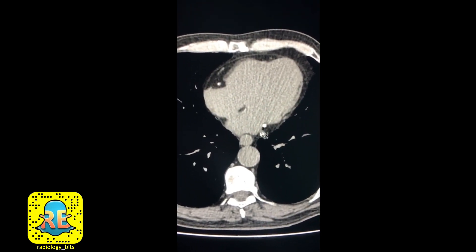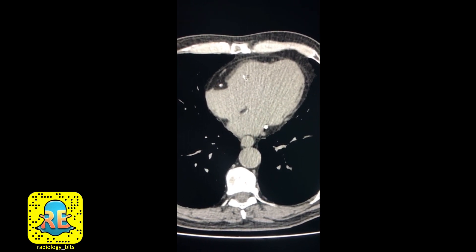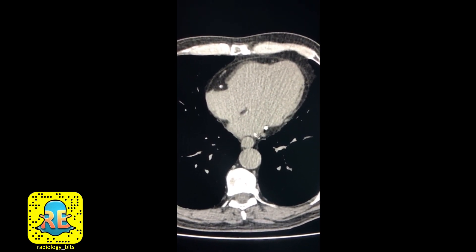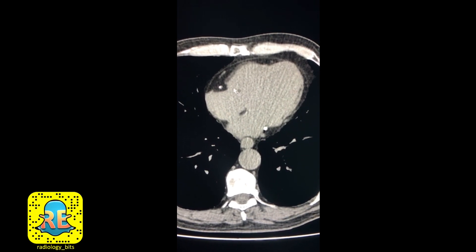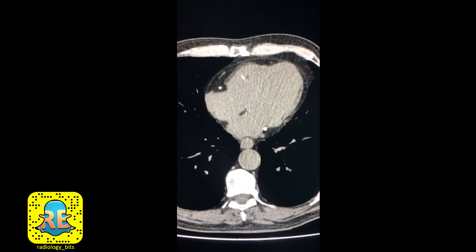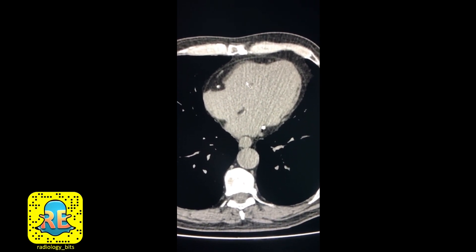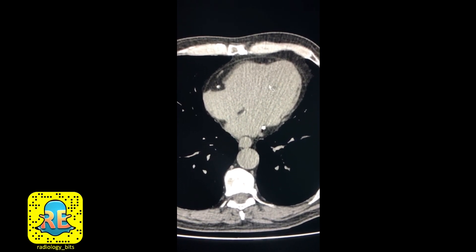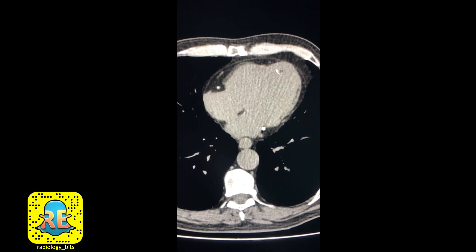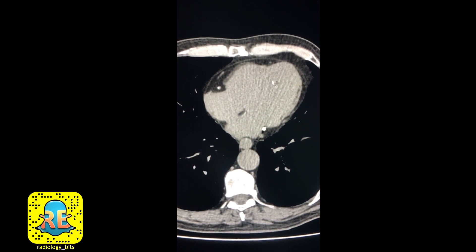What you're looking at is the heart with its four chambers. The heart looks like a soft tissue lump where you cannot differentiate between muscle and cavity without giving contrast. If this were a study with contrast, you would see enhancing cavities and soft tissue muscle, but this is not the case here.